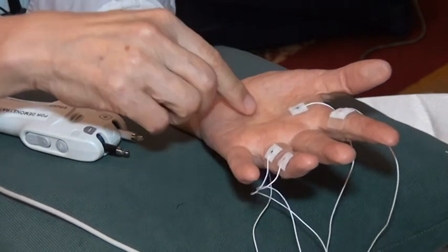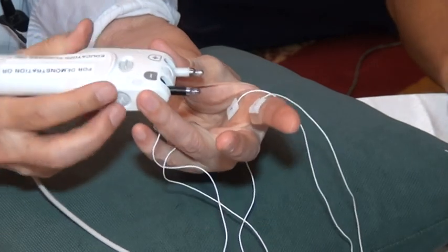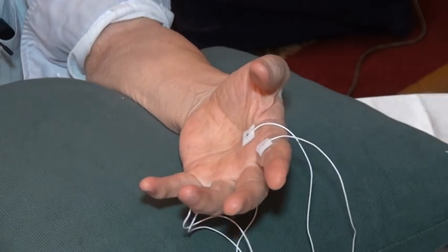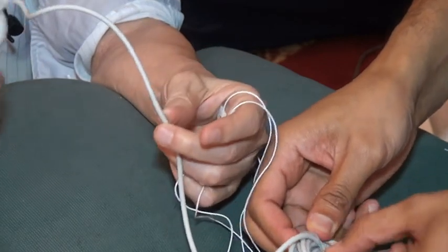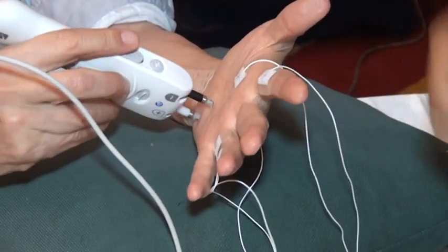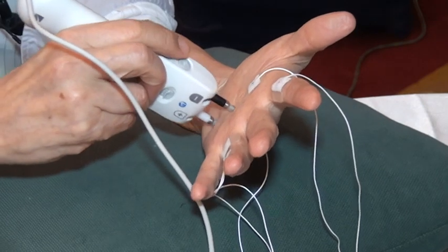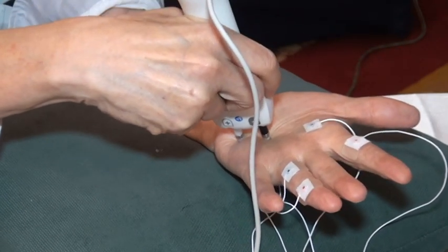All right, so let's do the inching here. I will delete this one. Delete everything, and I need the last sample. Let me show you something else we do often. That's right. Okay. So let me use 25 maybe or less, maybe higher. Okay. Can I try it? Yeah. Let me do this and then explain.